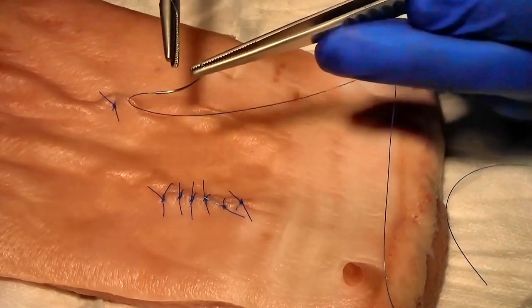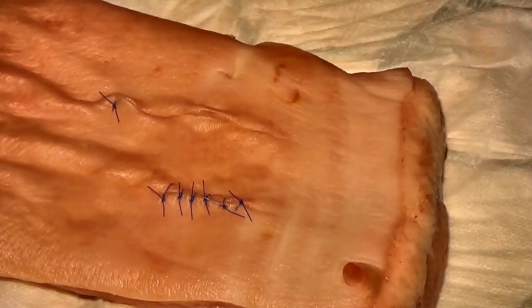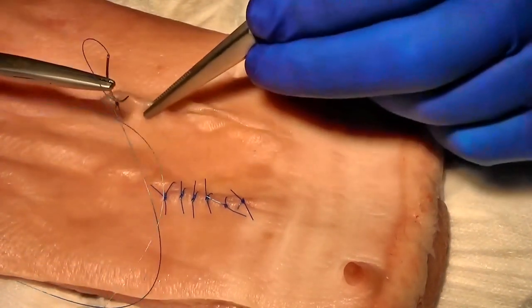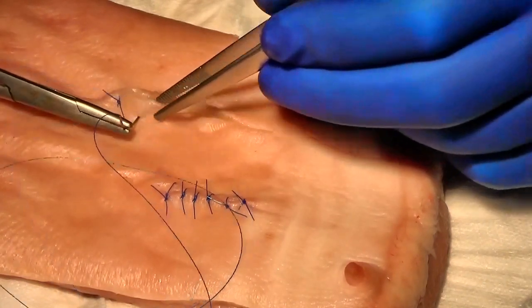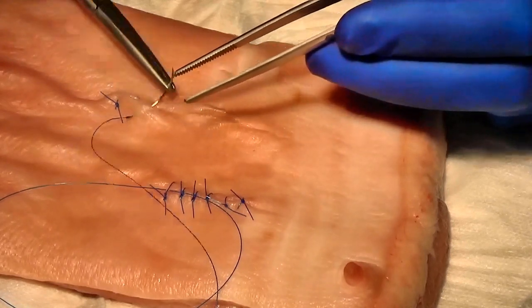Again, mounting the needle about 2/3 of the way along, through the skin at 90 degrees. Note the way I'm rotating the needle holder. Pick up with the needle holder and rotating the needle through the skin.